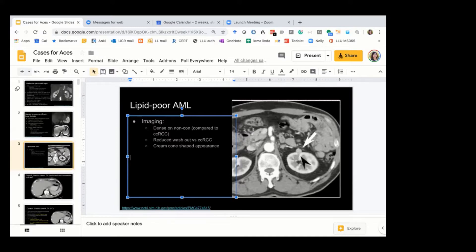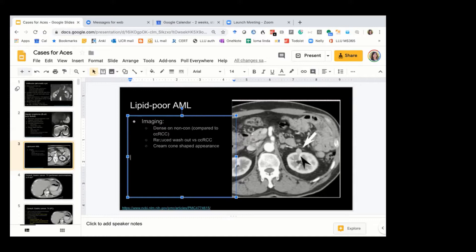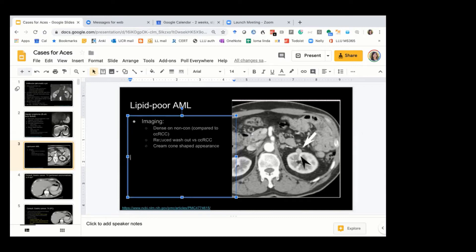I think the ice cream cone sign is a good one, because it's basically because it's a soft tumor — it's growing differently. A clear cell RCC will grow like a ball, whereas the AML has to have space to grow in the fat around the kidney. To me, it's pretty suggestive of an AML, so you could at least raise that possibility so they don't have to go to surgery — they could do a biopsy and ablate it at the same time.